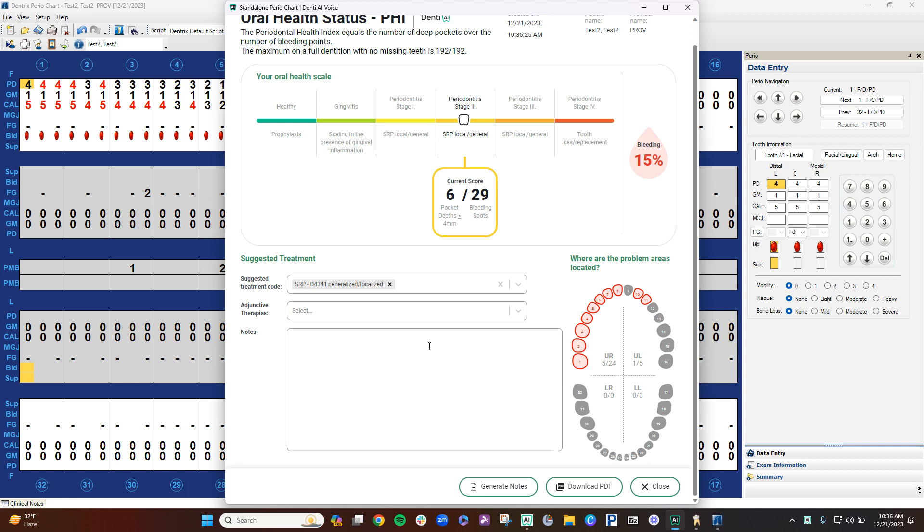Also, down here in the notes, you can type your own notes in here. You can add home care instructions or different notes that you want. We also have AI-generated notes based on the stage above. So I will show you what that looks like.